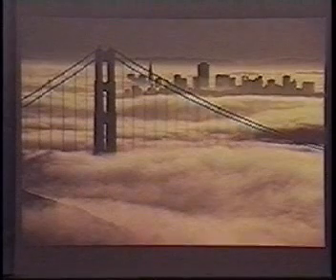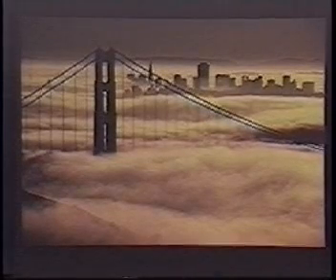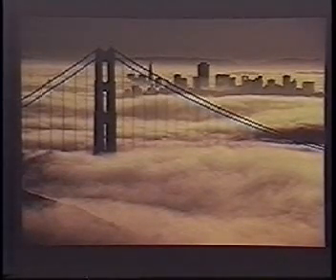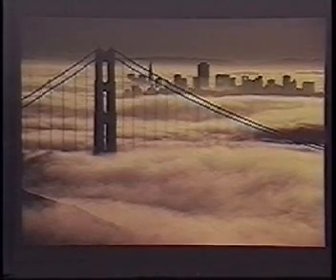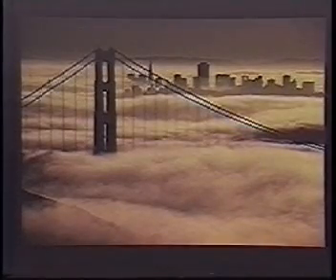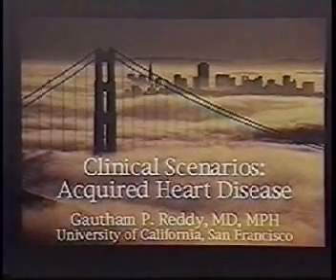I'm not going to be showing you a lot about how to do it or techniques, because I suspect that many people in this audience don't necessarily need to know all the technical aspects, but may be interested in case you see some cases or get referred some case. So I'm going to start out first with acquired heart disease, and towards the end I'll discuss congenital heart disease.